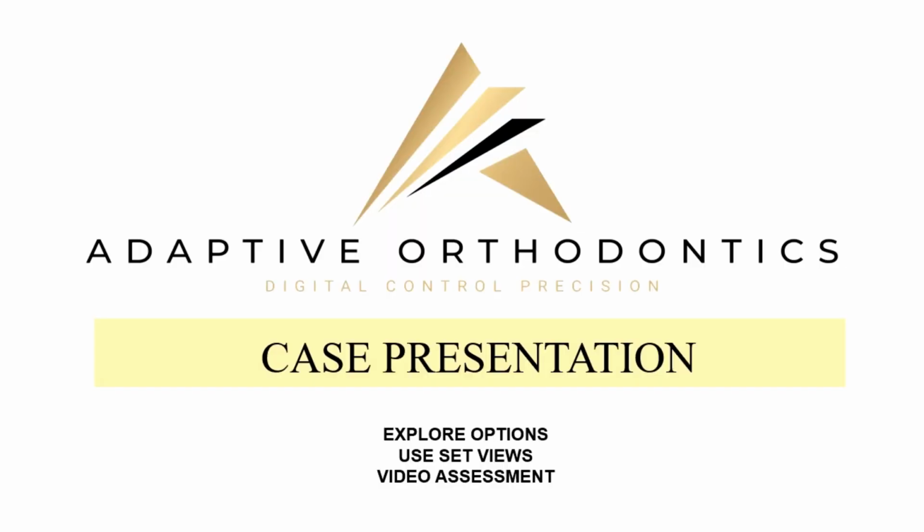Arguably, case presentation is the most important stage of your treatment delivery. If you failed here, your treatment has failed even before getting off the ground. Some finesse in the case presentation and judicious use of the software goes a long way to gaining patients' confidence and case acceptance.